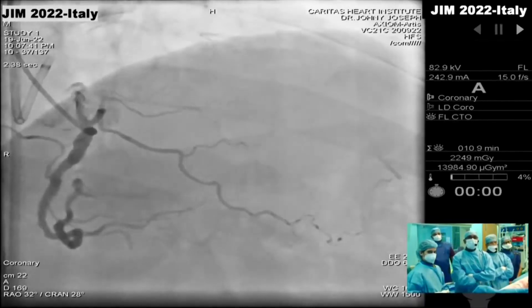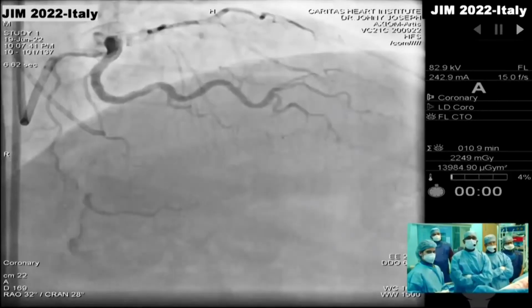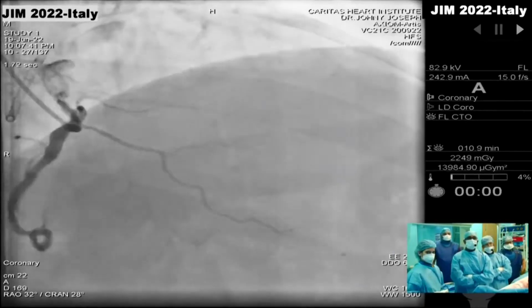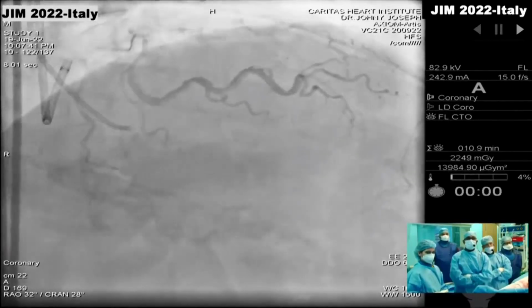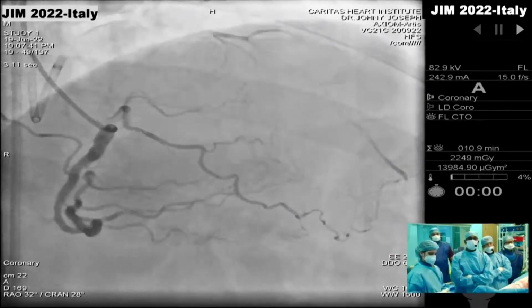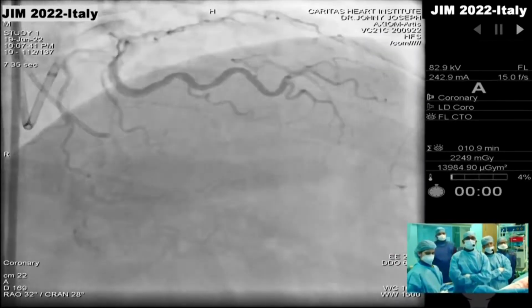Well, I think this is a great result, first of all, in the RCA. So that's definitely very encouraging for this patient. This means he has a favorable vascular response to angioplasty and stent. It's actually the tremendous collaterals that allow you visualization of your distal target vessel. I do agree there's a little bit of a stump there right after the first diagonal.